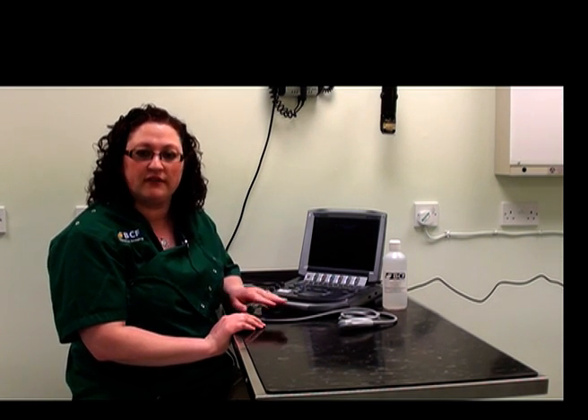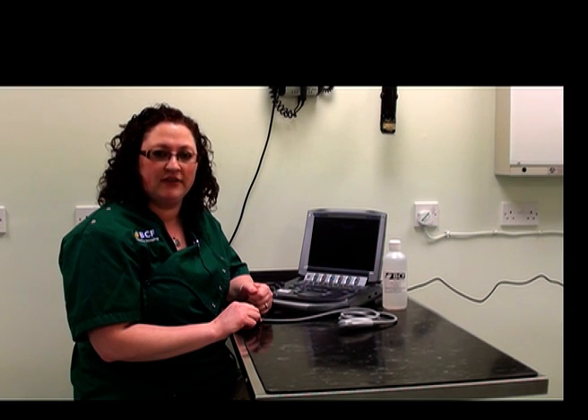Hi, my name is Kimberly Palgrave and I'm an in-house vet for BCF Technology. Today I will be demonstrating how to perform an abdominal ultrasound exam. First we'll start off by looking at the ultrasound machine itself and looking at the buttons and where they are, so that we can be very prepared for anything we want to do throughout the examination itself.